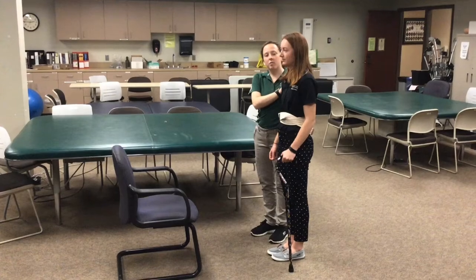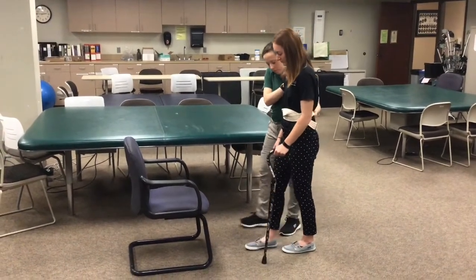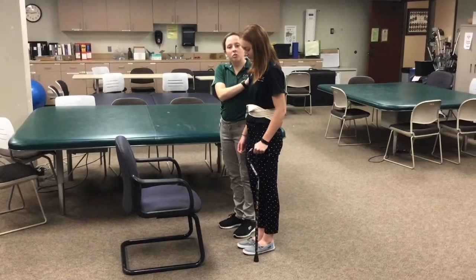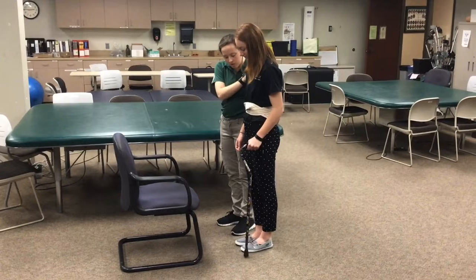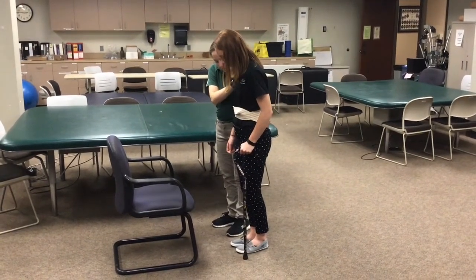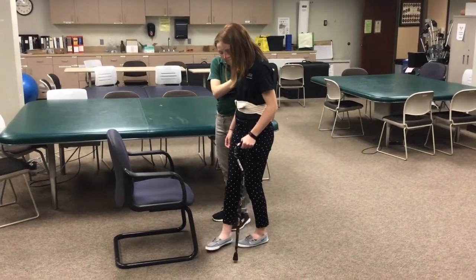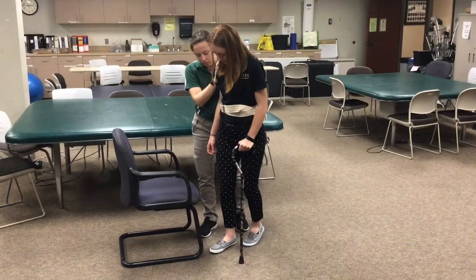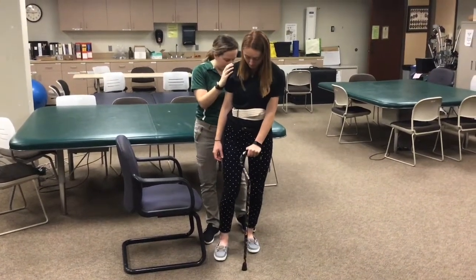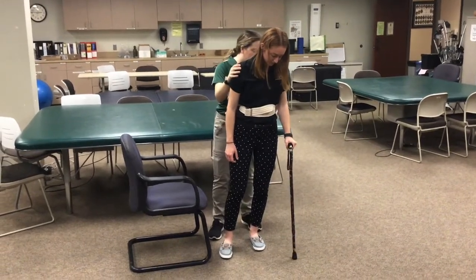Now we will cover how to return to sitting. Your patient will approach the chair, so go ahead and step forward. And when within sitting distance, they will do a small turn towards the uninvolved side. So first they will shift weight onto the uninvolved extremity, and then step with their cane and the involved extremity towards the strong side. And then they will pivot on their strong side by unweighting their heel. And then you can keep pivoting and replacing your cane.